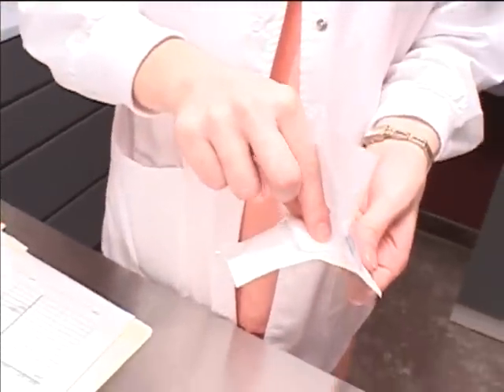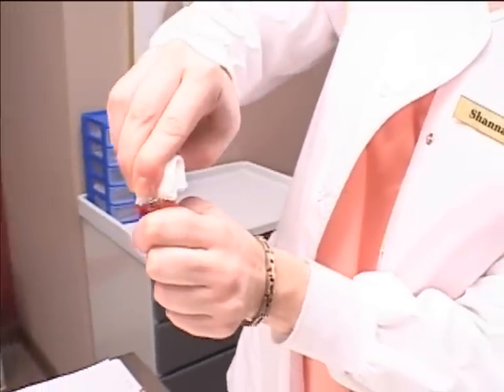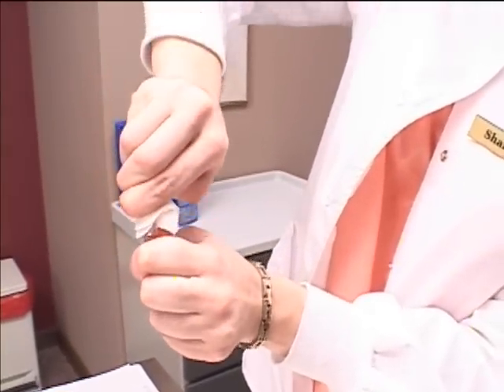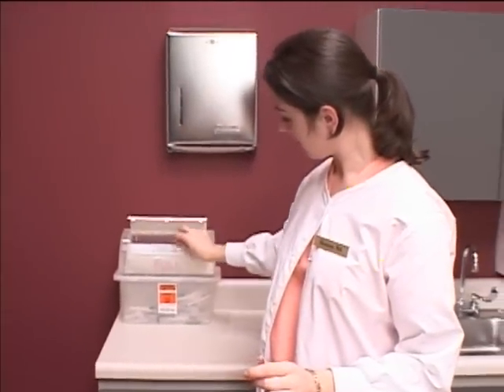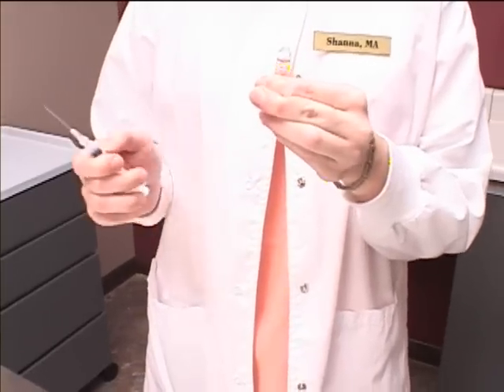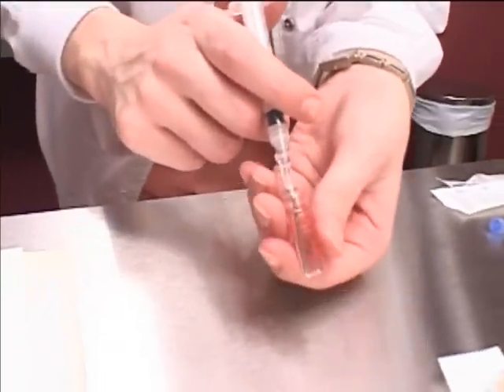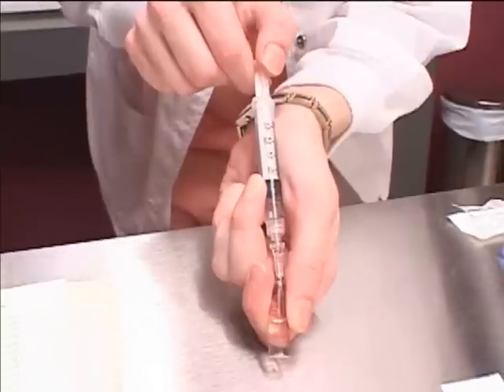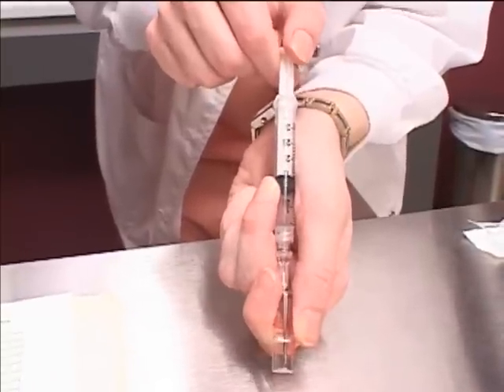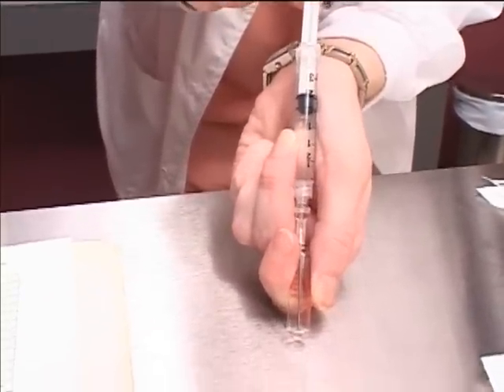Remove the sterile gauze, touching only one side, and wrap it around the neck of the ampule and snap off the top at the neck in an outward motion. Dispose of the top in the sharps container. Remove the needle cap and hold and tilt the ampule slightly with your non-dominant hand. Insert the filter needle below the level of the liquid and gently draw the liquid into the syringe, tilting the ampule as needed to access the liquid.